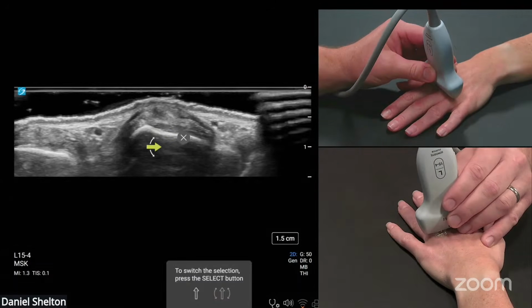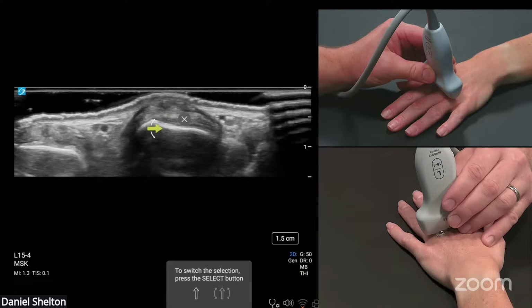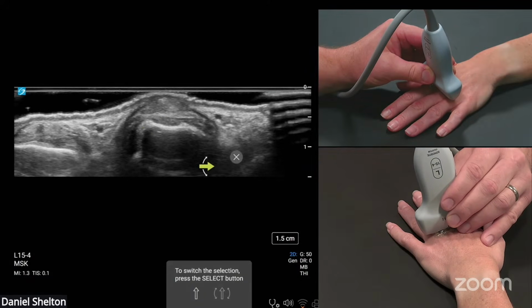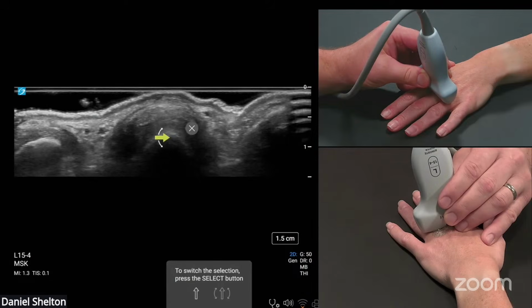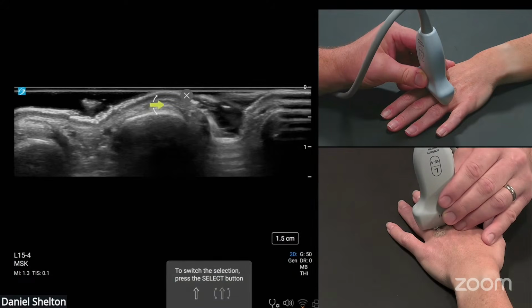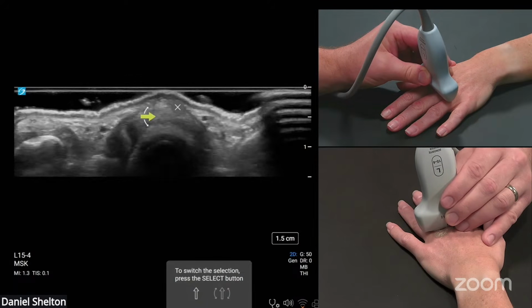Am I on the distal metacarpal or the proximal phalanx? There's a couple ways to tell that. So I can see that metacarpal notch that was discussed in the arthritic hand segment. I can see these dips on the side, which have a unique footprint for collateral ligaments. I can go distal and drop into the joint. So there I'm between bones, and then go distal a little bit more. And that shows me that I'm at the proximal phalanx. So it's always good to get oriented with the bones. So here's proximal phalanx, joint as I go proximally, and then distal metacarpal head.